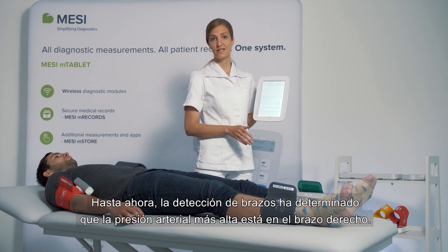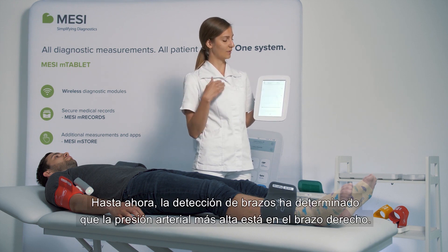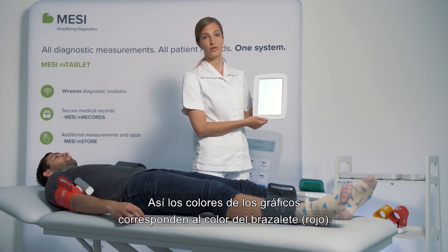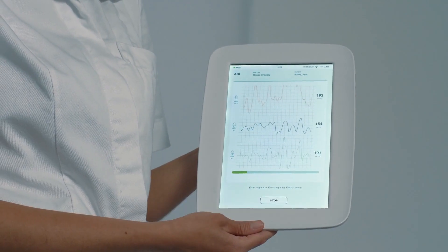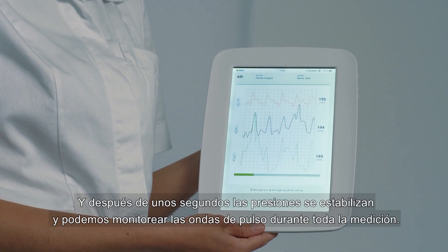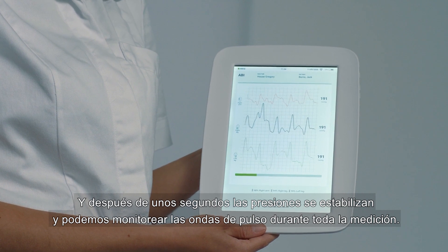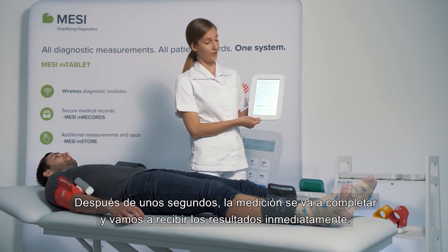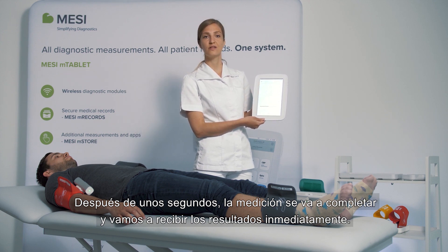The smart arm detection determines that the higher of the two arm blood pressures is the right arm, and the colors of the graphs correspond with the color of the cuff. After a couple of seconds, the pressures level out and we can monitor the pulse waveforms throughout the entire measurement. The measurement will then be concluded and we will receive the result immediately.